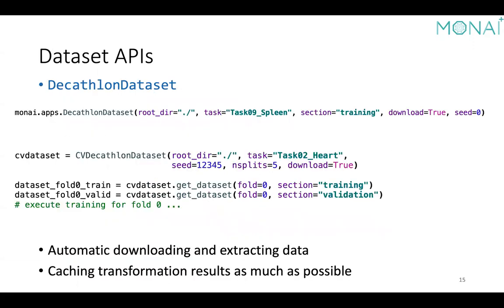At a higher level, MONAI provides a ready-to-use API for public datasets. It supports automatic data downloading and training/validation splits. More recently, we added a cross-validation wrapper for this dataset, so we can dynamically fetch cross-validation folds when setting up experiments. This dataset also supports the built-in caching mechanism.